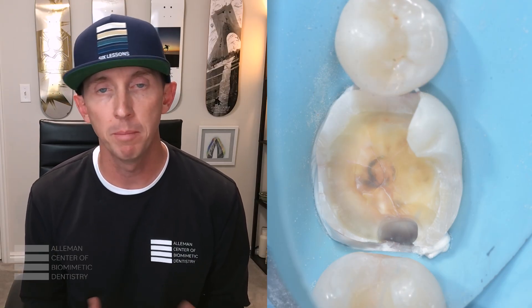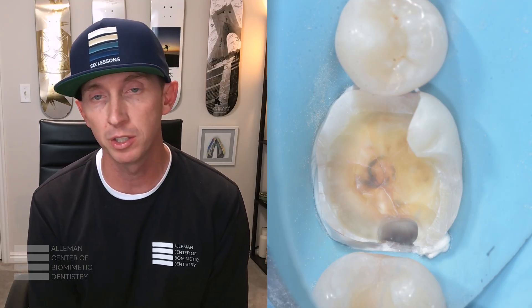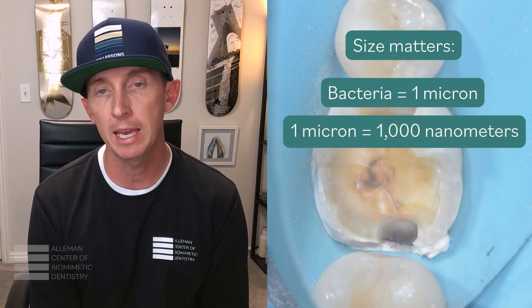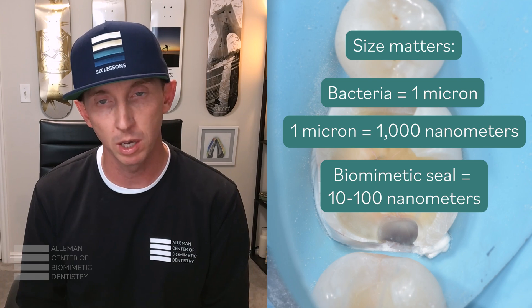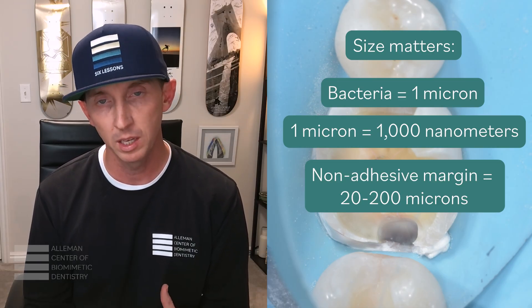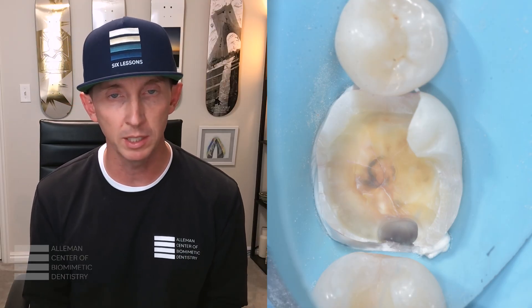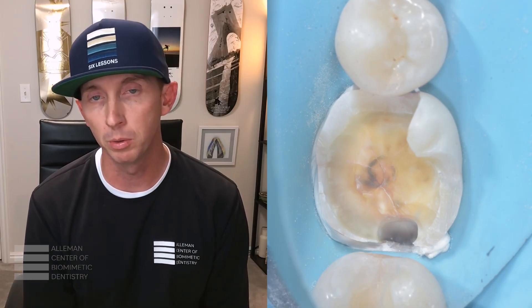The old dogma of biologic width invasion is really challenged when we do a proper deep margin elevation. Our seal is on the nanometer level, which is too small for bacteria to physically enter and create a chronic inflammatory response of the soft tissue. Traditional dentistry will have gaps on the micron level that are large enough for bacteria to accumulate and create a cascading effect of inflammation, which most dentists have seen underneath an old leaky crown approaching crestal bone.